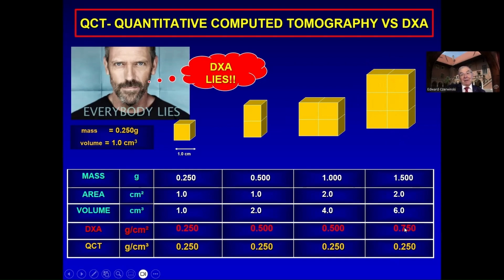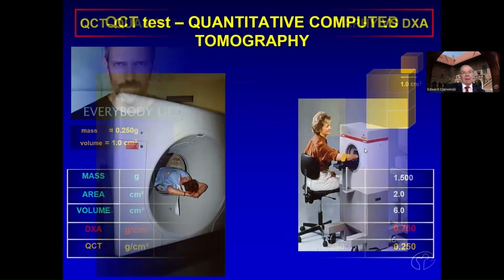That means you got information about the total mass, not about the specific mass. And surely this total mass better correlates with bone resistance to fracture. This is why we use the not realistic, from the physical point of view, measure of density per square centimeter.